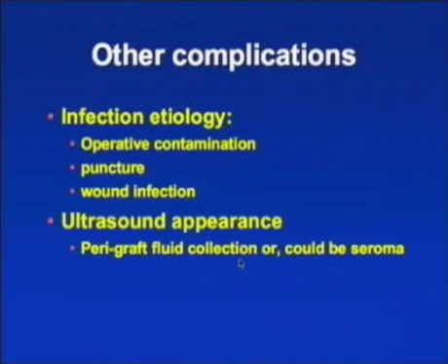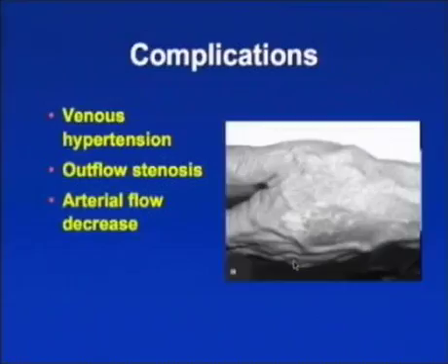Also, there's sometimes a swirling appearance within the infection, but keep in mind that this also can be a seroma, which is not uncommon in Gore-Tex graft hemodialysis access grafts. Now, another interesting complication is venous hypertension. This can result because of outflow stenosis with concomitant arterial inflow disease.